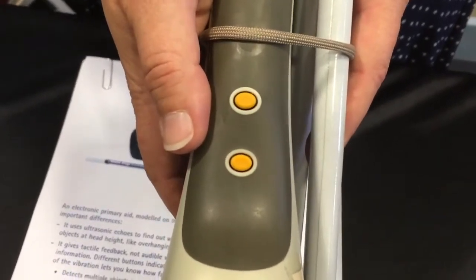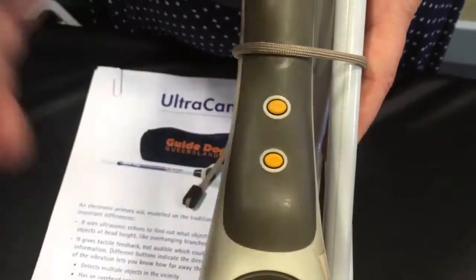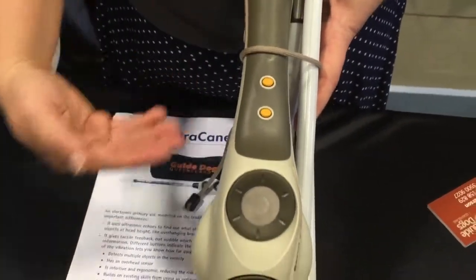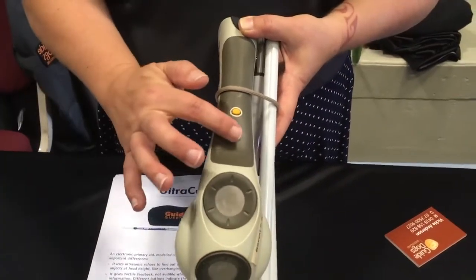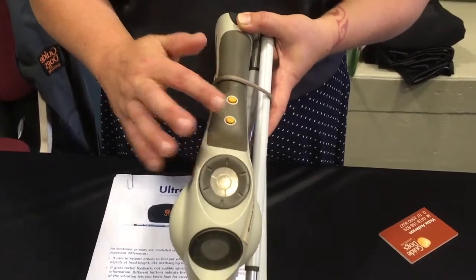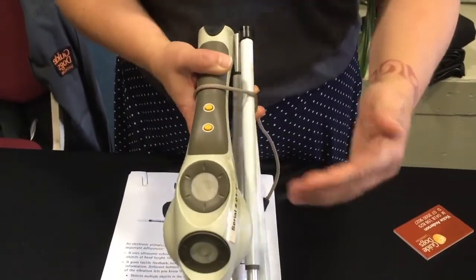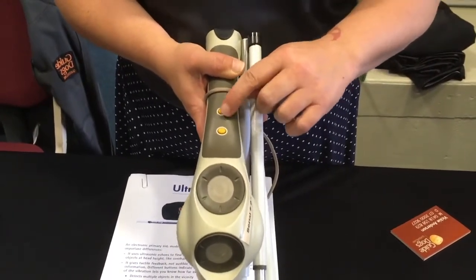Those buttons are on the handle. They vibrate to correspond to whichever sensor detects something — so if there's something waist high, say a rubbish bin is in your way, then the bottom sensor button would vibrate to let you know. The same with the top one — the top button will vibrate if the upper sensor is triggered.